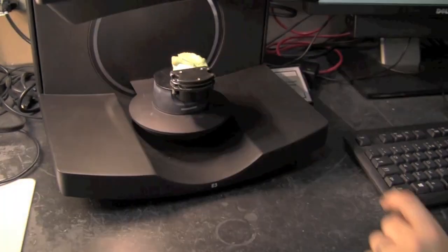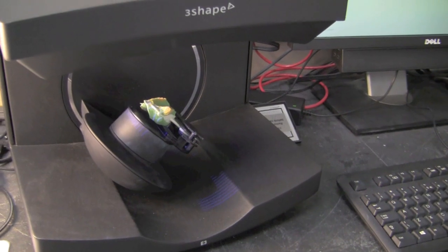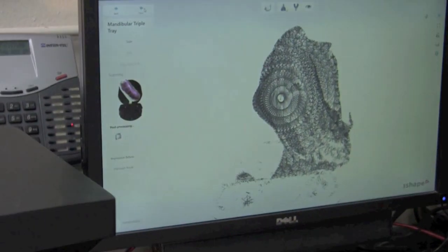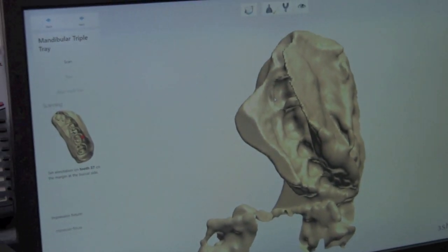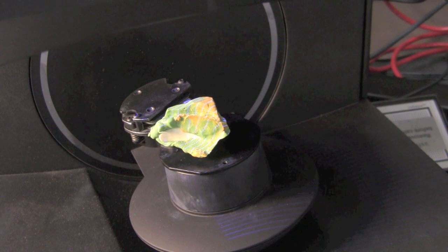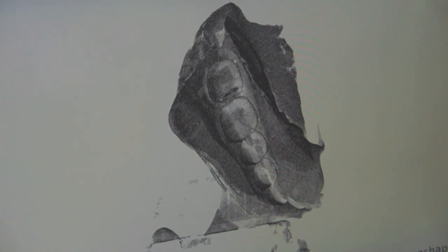You want to make sure that you do not move it while it's on the clamp unit, otherwise the bite will not line up at the end. Since this is our prep side with the prep tooth on it, we're going to want to select our prep tooth. All we're going to do is come over to the buccal surface and select one spot on it — just left click — and then it will continue scanning.